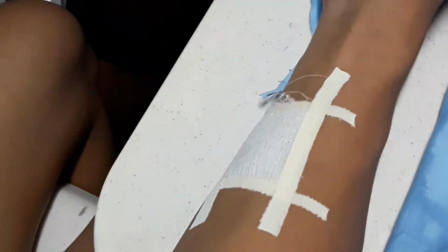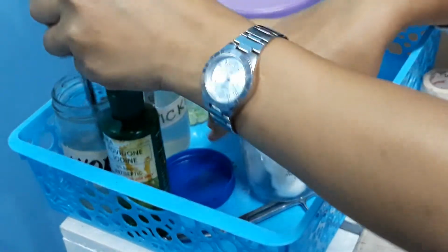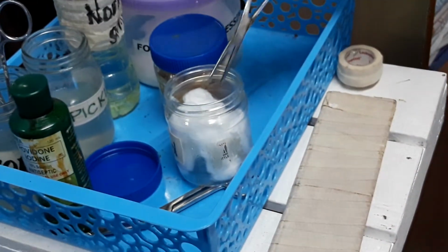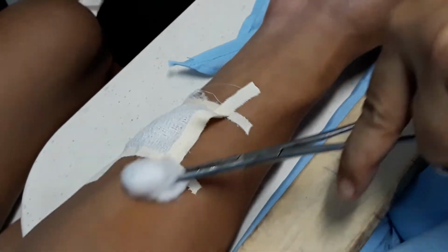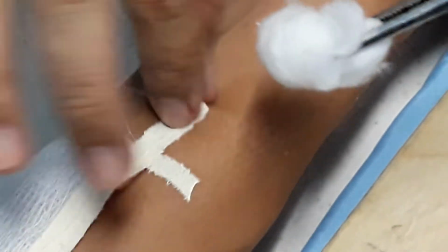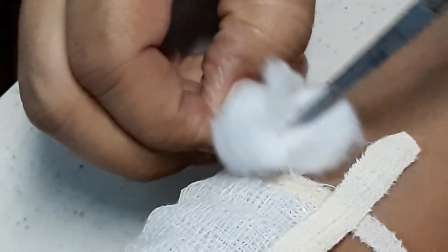And when you're going to undo the dressing for changing, you have to soak the area with a cotton ball soaked with alcohol. Okay, this one, and then transfer it into your working area. When you're going to transfer it, make sure that the forceps don't kiss each other. And then apply now your alcohol, like this. And you have to remove first the uppermost plaster like that. Okay. So like this.